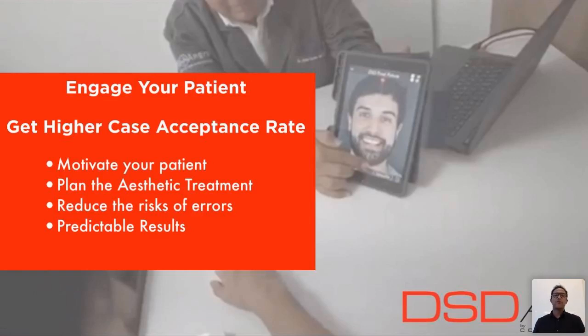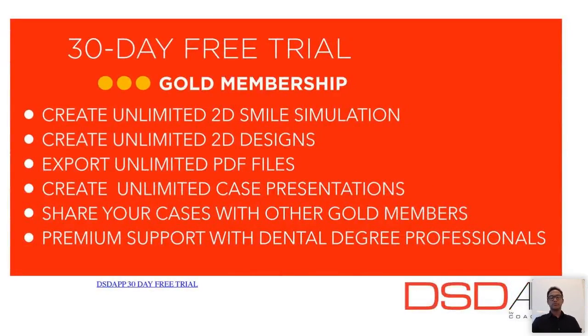So what is the goal of starting today with the DSDApp? The goal here is for you to engage a patient and get a higher case acceptance rate. So we want you to motivate your patient to plan aesthetic treatment, to reduce the risk of errors, to get that confidence back to your patient, and make sure that you deliver this harmonic smile to your patient. And how do you do that? You will do that by starting your 30 days free trial. And I'll show you here how you can sign up.